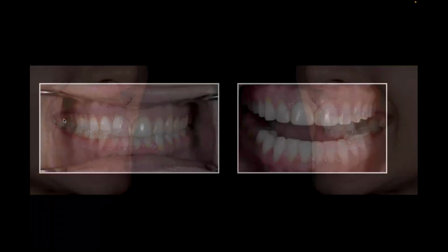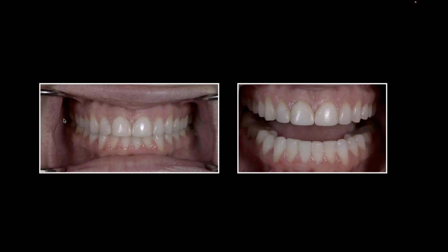And in her biggest smile, when she's laughing and really letting go, you can see she shows a lot of pink. That was problematic too for us, because look at the size of these bicuspids, right? When I look at that little tiny tooth, all I'm thinking is I don't really want to lengthen this very much. I really like to lengthen it gingivally. So this for us becomes about where the teeth belong in this patient's face. We already like the incisal edge position, although I'd be okay if we lengthen that maybe 0.5, maybe even almost a millimeter to give her a little bit more length.